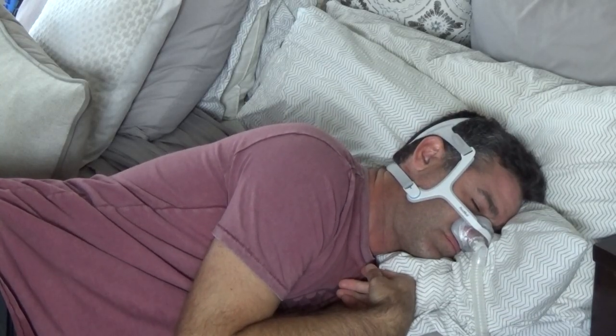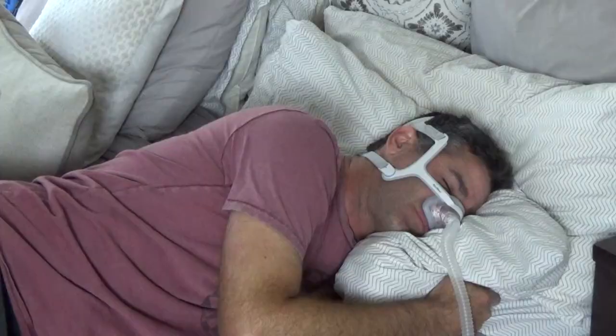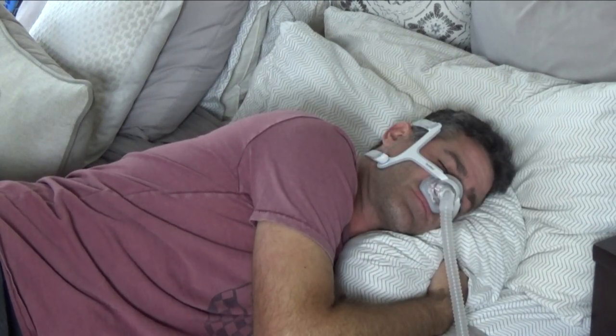Let's do a quick pressure check. This is at 10 centimeters of water pressure. Now let's do 20 centimeters of water pressure. If you want to learn how to turn the pressure up on your machines, check out my other videos. I just want you to hear this — it's on 20 centimeters of water.